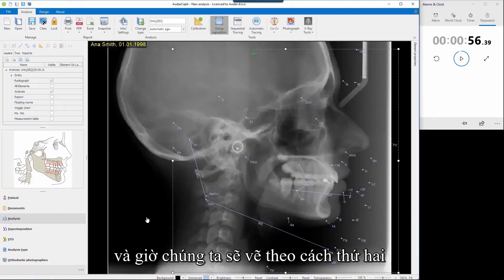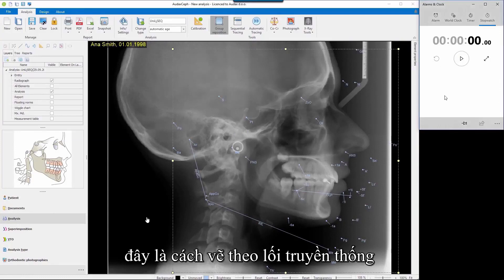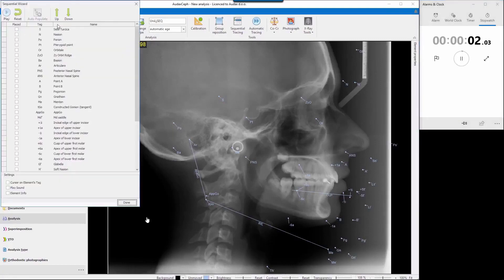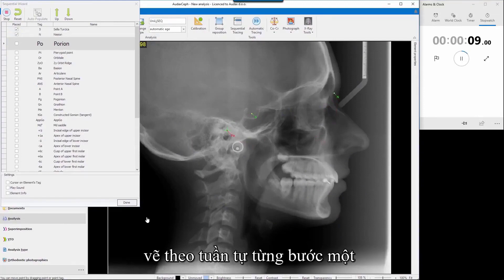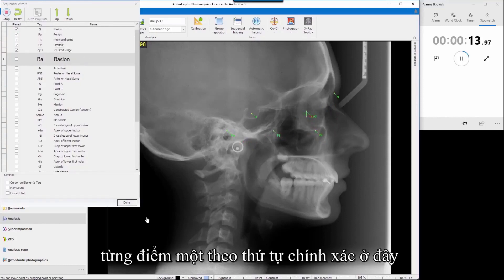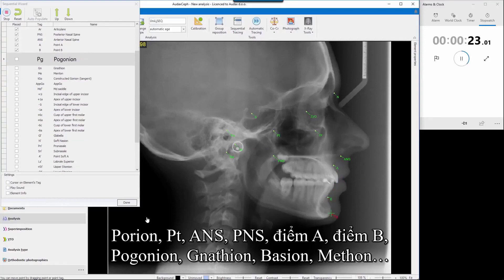I'll trace sequentially — it's a very old-fashioned way of tracing. I'll restart the stopwatch and start tracing now. Sequential tracing, one by one — I put points one by one in exact order: Basion, Articulare, PNS, ANS, A point, B point, Pogonion, Gnathion, Menton.